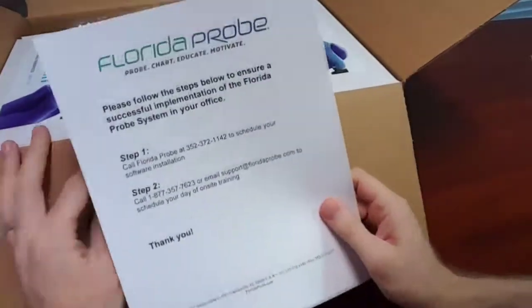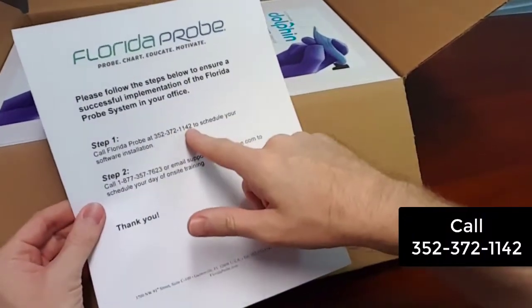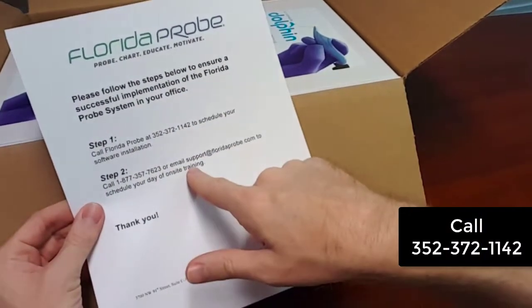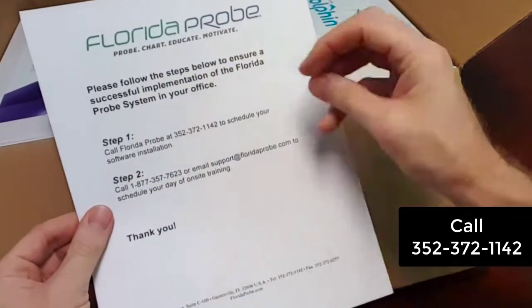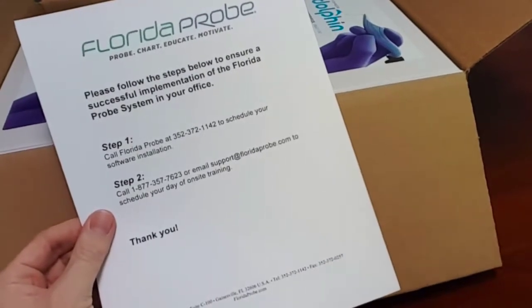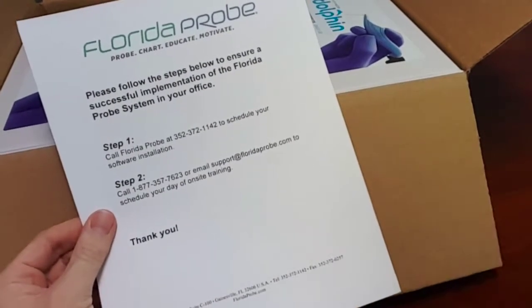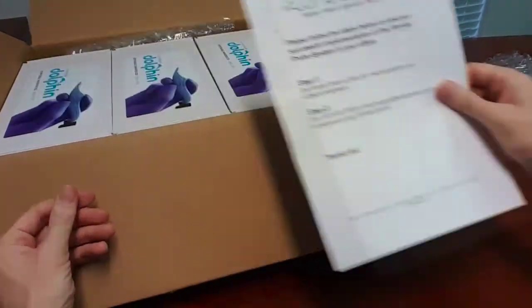When you open the box, you're going to notice there's a basic letter here to call and go ahead and schedule your software installation and set up your day of on-site training. Each Florida Probe system actually comes with a dental professional to come to your office and give you a full day — six to eight hours — of on-site setup and training.